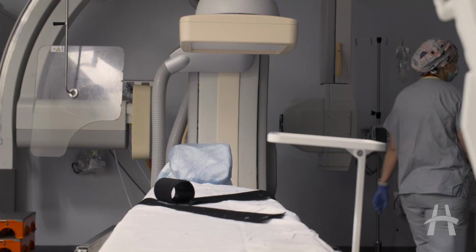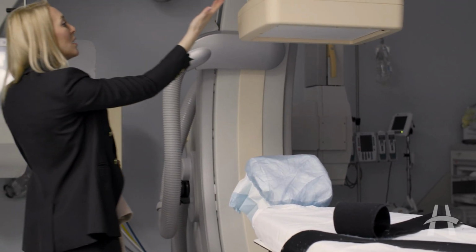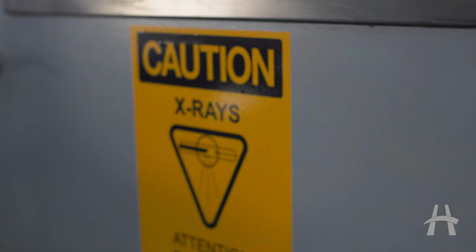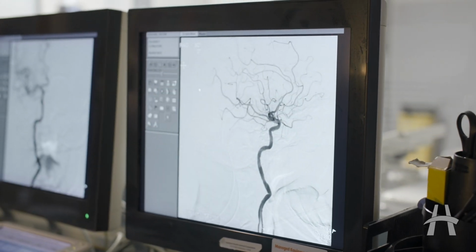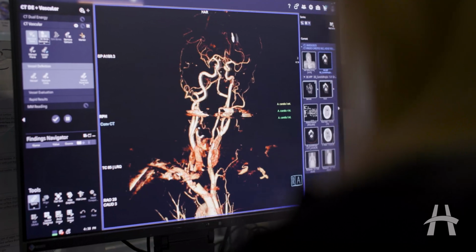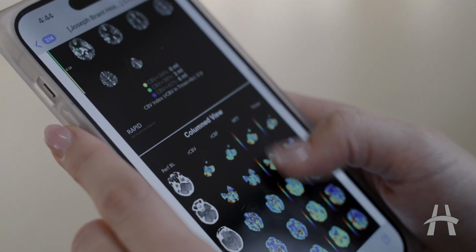It's called an angiography suite. So patients are transferred into this suite, and after some local anesthesia in the groin, a wire is placed in that femoral artery. It's a very big blood vessel in the groin. And then with the use of X-ray based imaging, it's navigated carefully all the way up to the brain. And once it reaches that area of occlusion, then we can use either a suctioning machine or a stent to mechanically remove this clot, restoring blood flow.